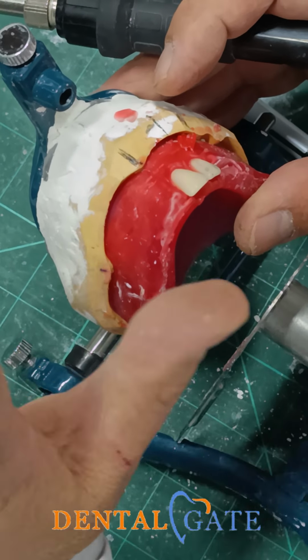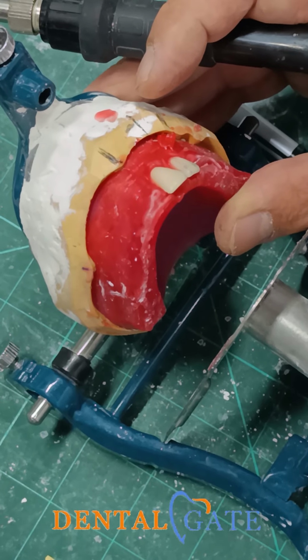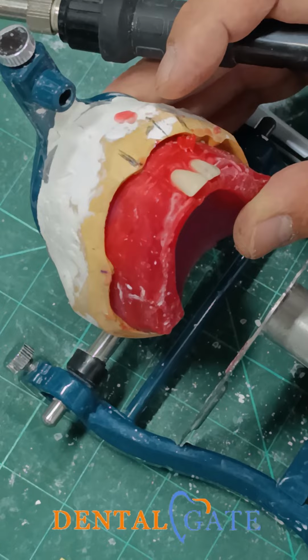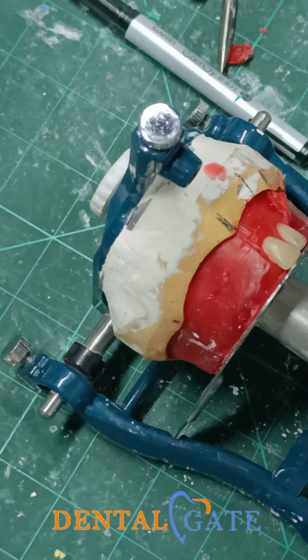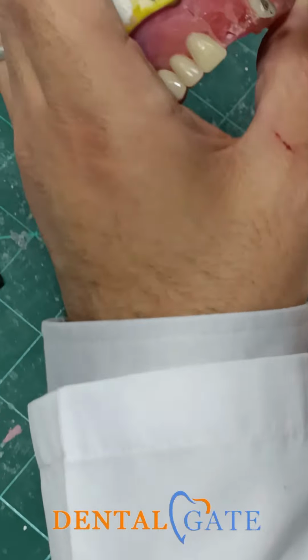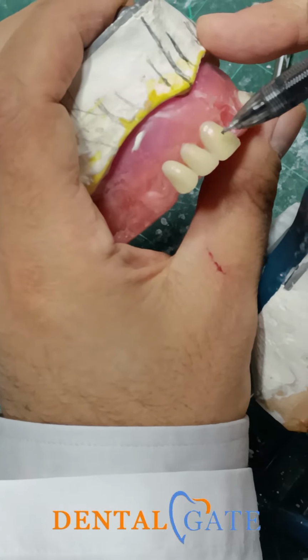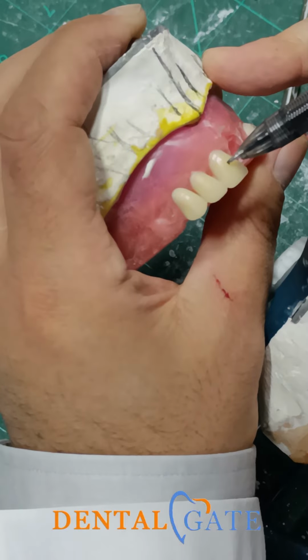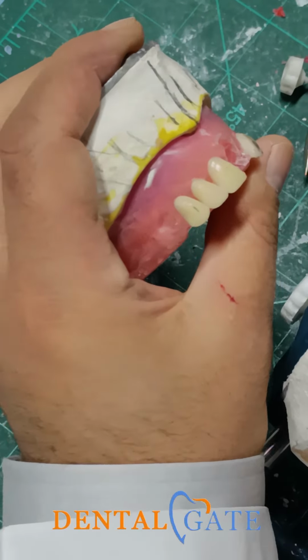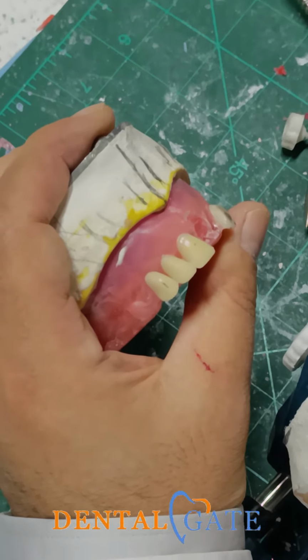One surface is for the anterior region, and this will impact the golden proportion. If you count the golden proportion, you count just this area, not the whole canine. If we have a golden proportion, I will account for the central, the lateral, and this portion. So this portion will impact the aesthetics.